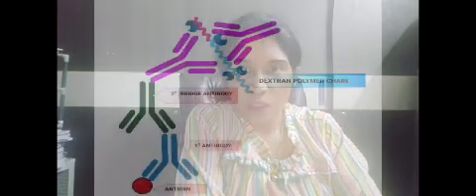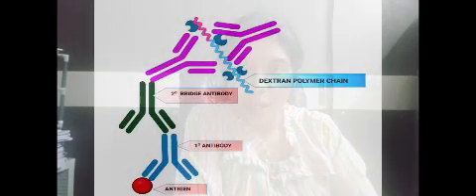There are novel methods like usage of horseradish peroxidase binding to the secondary antibody, which uses a dextran polymer. So these methodologies have gained popularity because it allows a multicolor panel to be used in the staining of the IHC. So these are the basic methods of labeling of IHC.